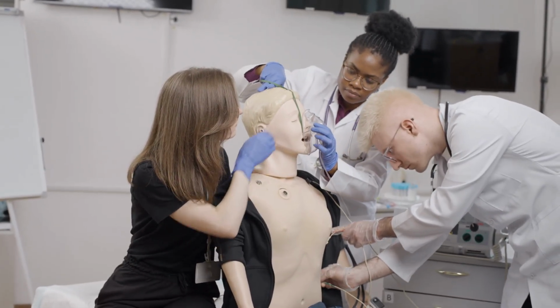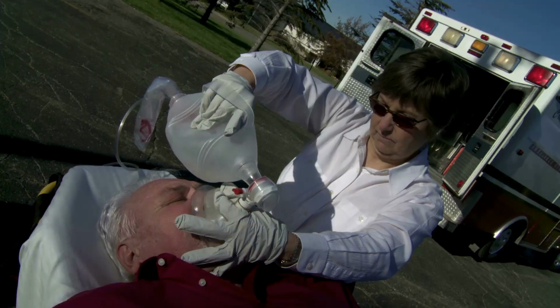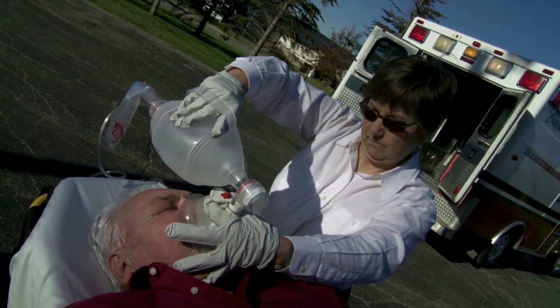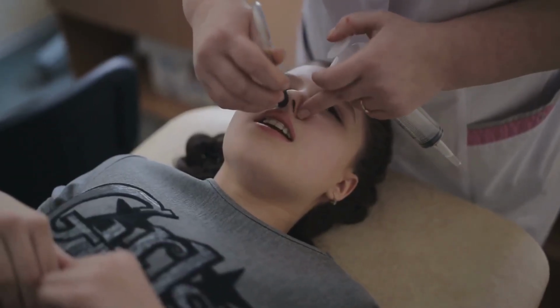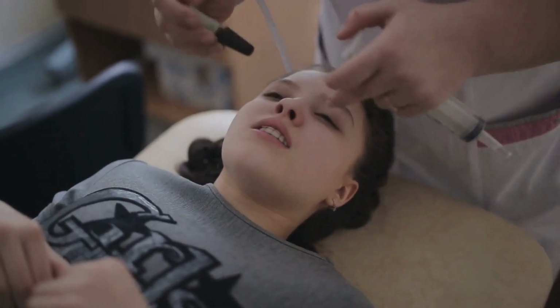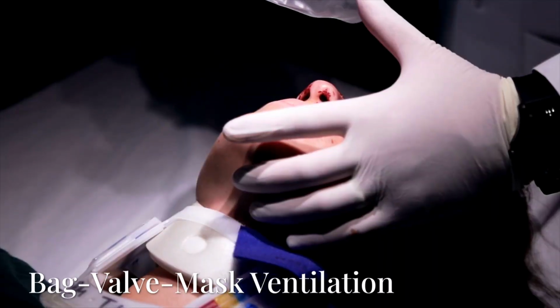Start with the basics. Open the airway manually and suction as needed. Use an oropharyngeal airway, OPA, in unconscious patients with no gag reflex. For patients who are semi-conscious or have a gag reflex, use a nasopharyngeal airway, NPA, if not contraindicated by facial trauma.